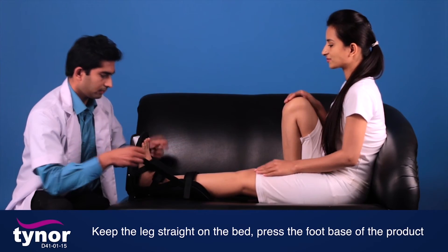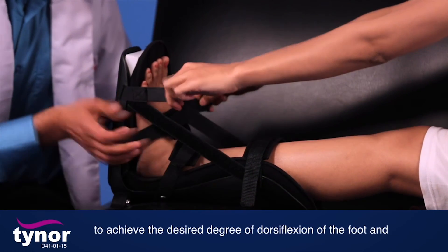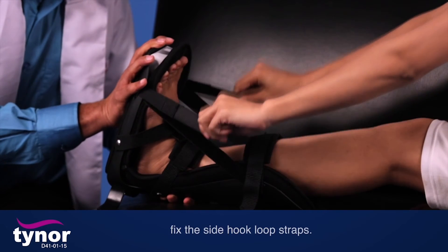Keep the legs straight on the bed. Press the foot base of the product to achieve the desired degree of dorsiflexion of the foot, then fix the side hook-loop straps.